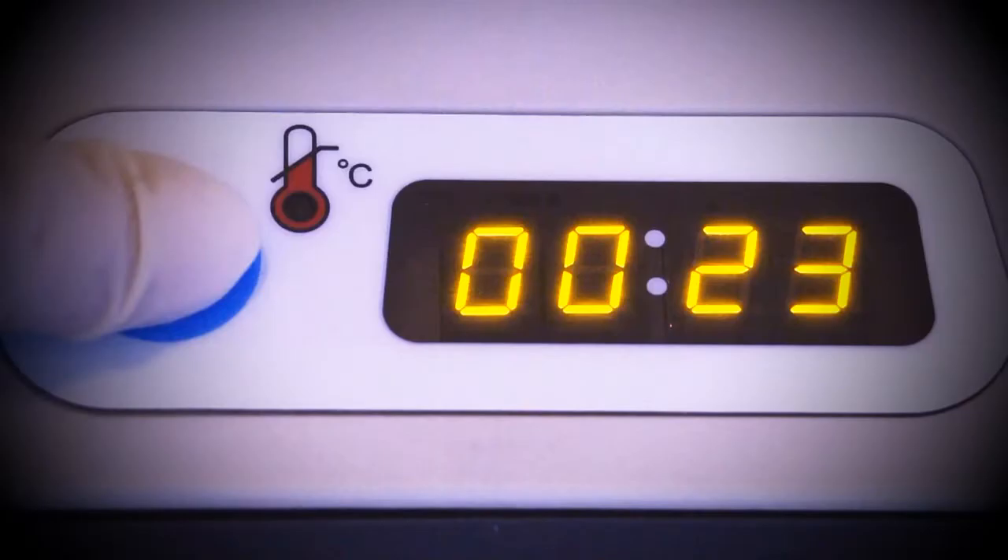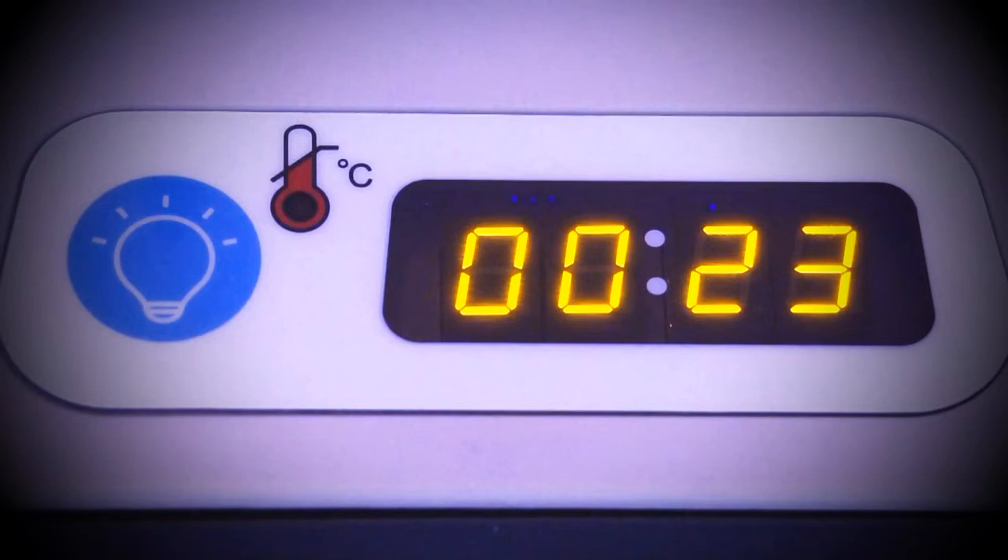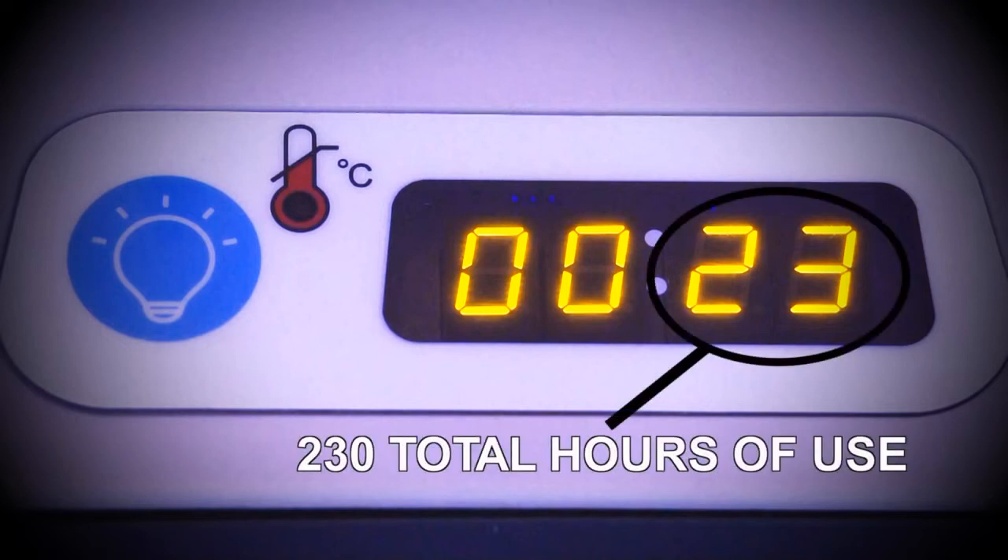When you turn on the machine, the display screen will light up. The display tells you two pieces of information. For the first three seconds after you turn on the device, the display will indicate the number of hours that the Firefly has been used since manufacturing. To determine the total hours of use, you need to multiply the number displayed by 10. For example, this device shows the number 23. After multiplying it by 10, we know that the device has been used for 230 hours.